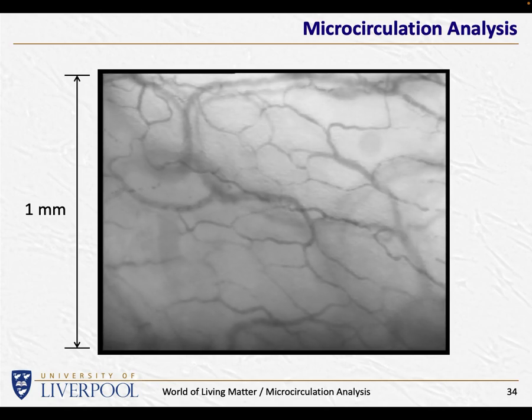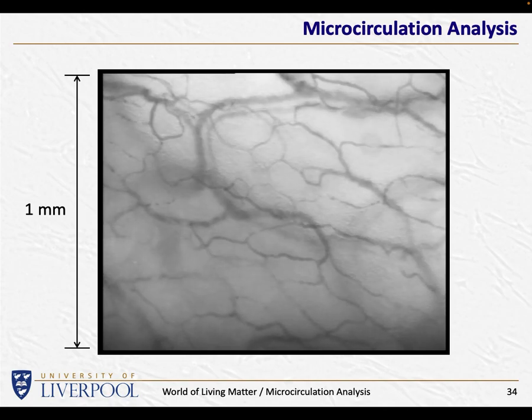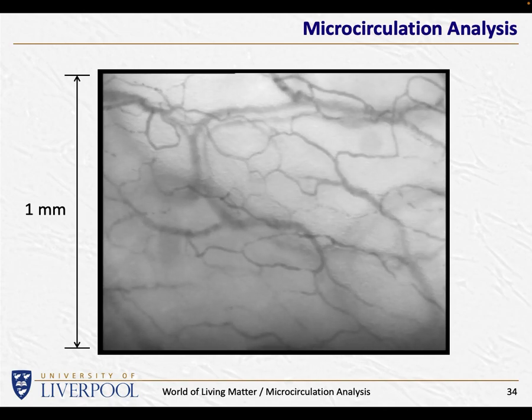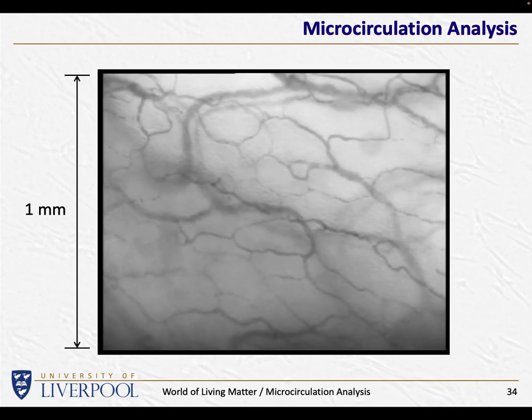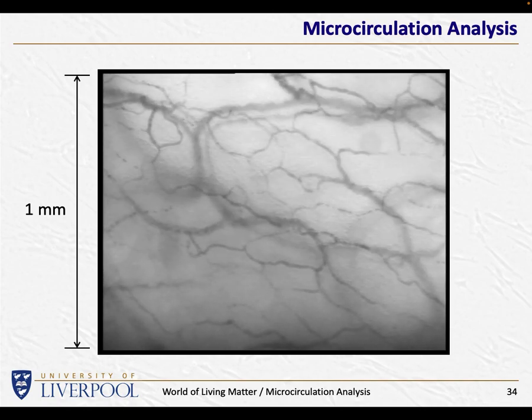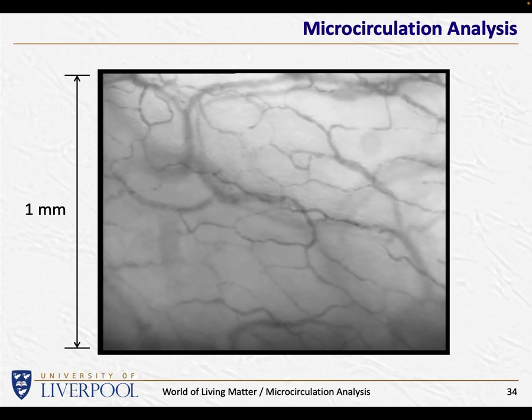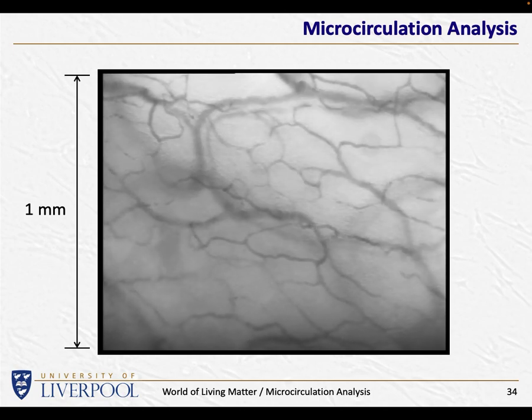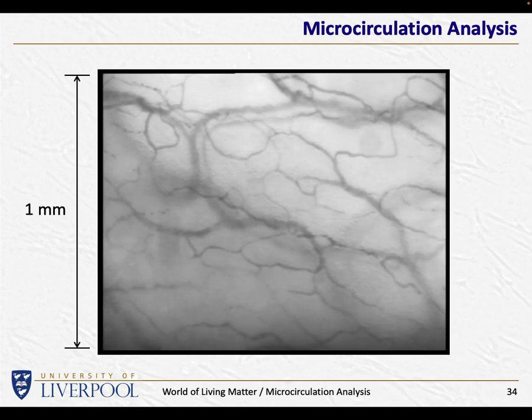In the video, perhaps I need to come onto this side and point at it, you can see individual blood cells moving. Some of them are moving quite rapidly and the circulation is fine. Some of them are hardly moving at all. You see these blood cells, these dark features, they don't seem to be moving in a consistent way. Sometimes they move in one direction and then stop and move backwards for a little while and then move forwards again.